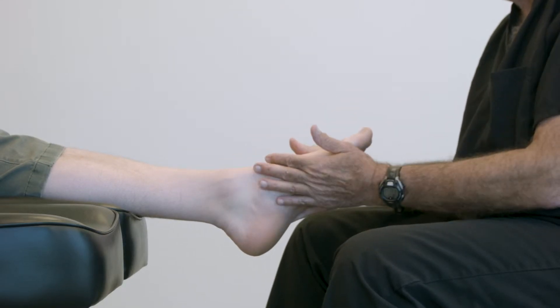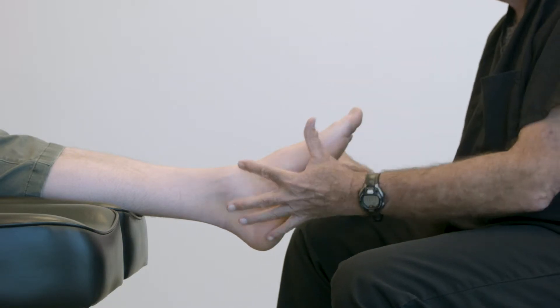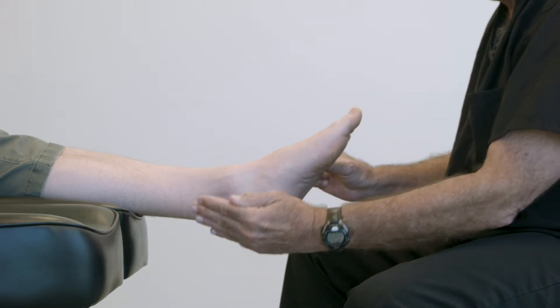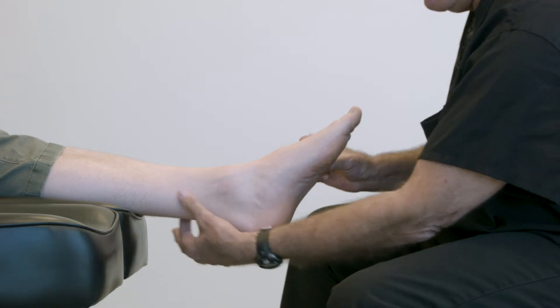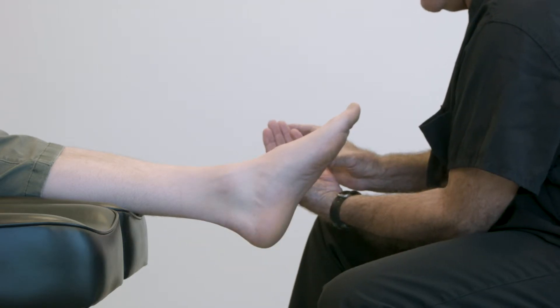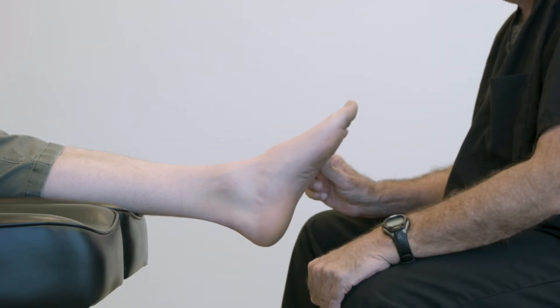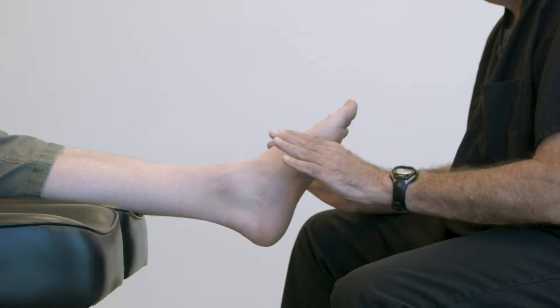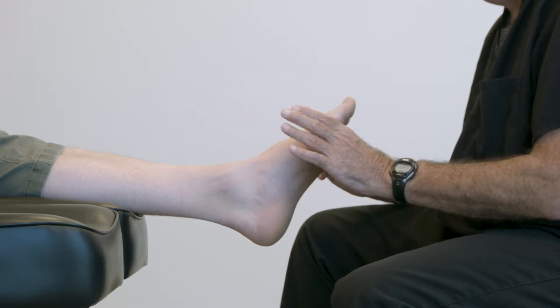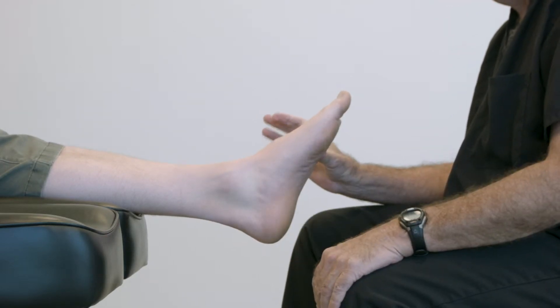Traditionally, practitioners are trained to cast the foot in this position with the patient supine. This is not the optimal position to take a digital scan, because the person taking the scan is going to have to come all the way under the heel to capture the image of the calcaneus to the leg and come back out the other side of the foot. This is hard to do to get under the foot and take that view. So what we're going to do is put the patient in a prone position, which is a much better angle for taking a digital scan.